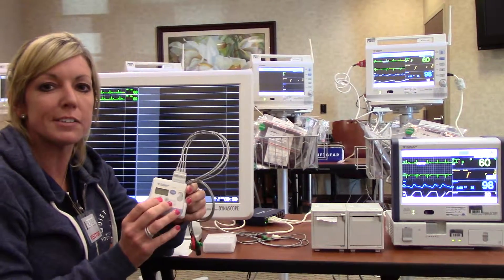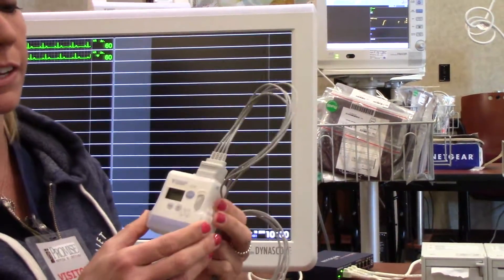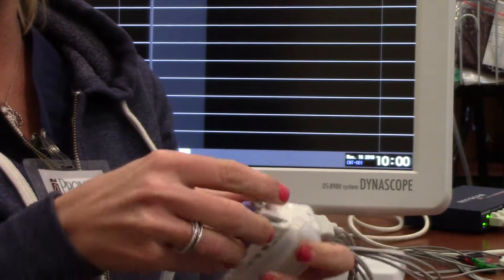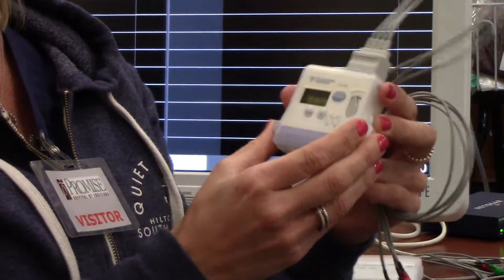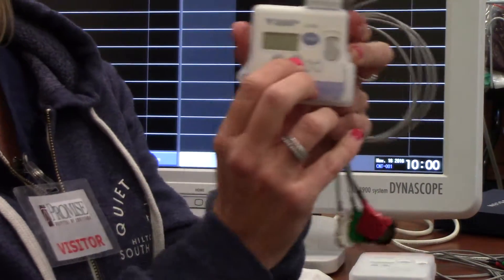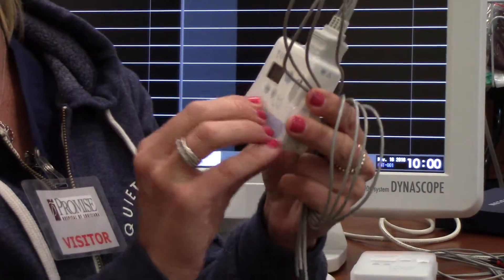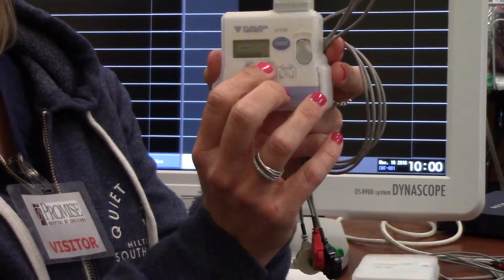We're going to start with the telemetry boxes. I'm here at the Promise Facilities. The unit is small as you can see. It has a simple on-off switch and requires one AA battery inserted in the bottom. Once the battery is inserted, you can turn on the device. You will see the screen illuminate. The screen displays two ECG waveforms, the heart rate, and the respiratory rate with your small 7120 telemetry box. You can scroll through the screen using the arrow key to get your different numeric and waveform pictures.